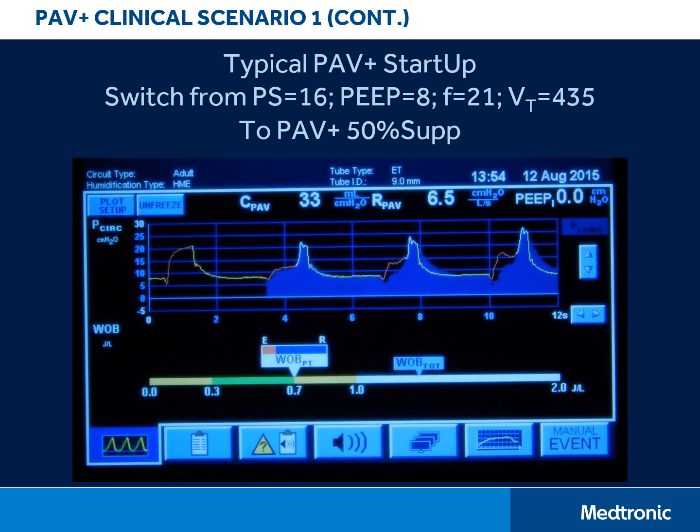On the left is the last pressure support breath, followed by the first PAV breath. You can see that there are inspiratory holds being done throughout the PAV startup, and these are indicated in white. This is how PAV Plus obtains the starting average values for compliance and resistance over at least 4 breaths.